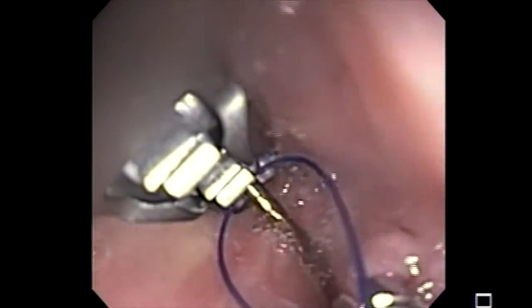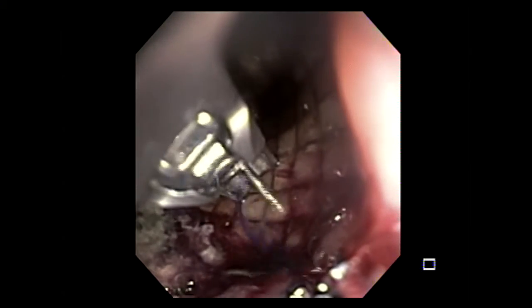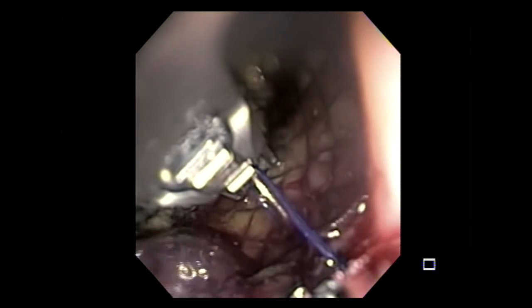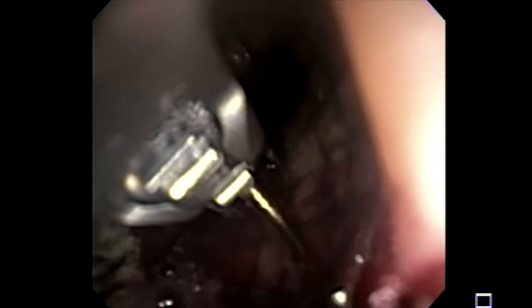For the overstitch device, you will need a double-channel endoscope. As we see here, we already preloaded the suture over the overstitch device, and we're going to use the needle now to penetrate through the stent and esophageal wall. It's very important to make sure that you are going deep enough within the esophageal mucosa, so that you have enough mucosa to hold the suture.